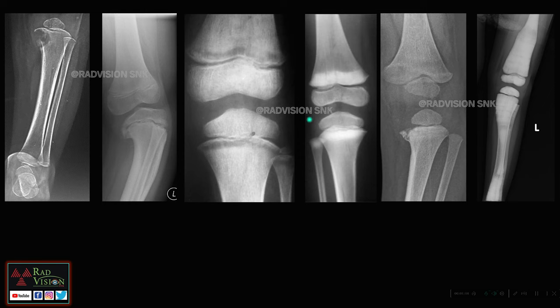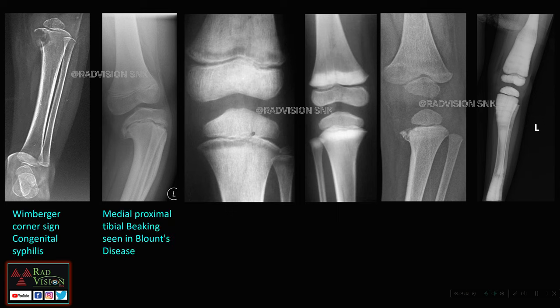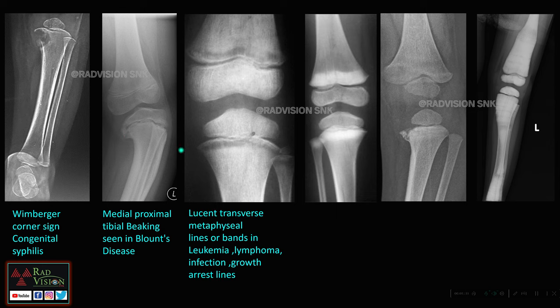Next, we'll see different tibial lesions commonly encountered as spotters. We've already seen metaphyseal destruction of the medial proximal tibia in congenital syphilis. Next is medial proximal tibial spiking — medial proximal tibial beaking or spiking — seen in Blount's disease. Next, linear transverse metaphyseal lines or bands are seen in leukemia, lymphoma, infection, or growth arrest lines.